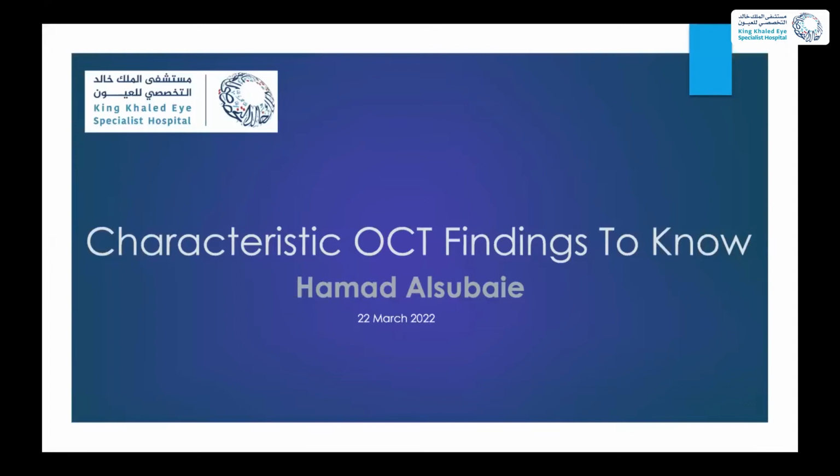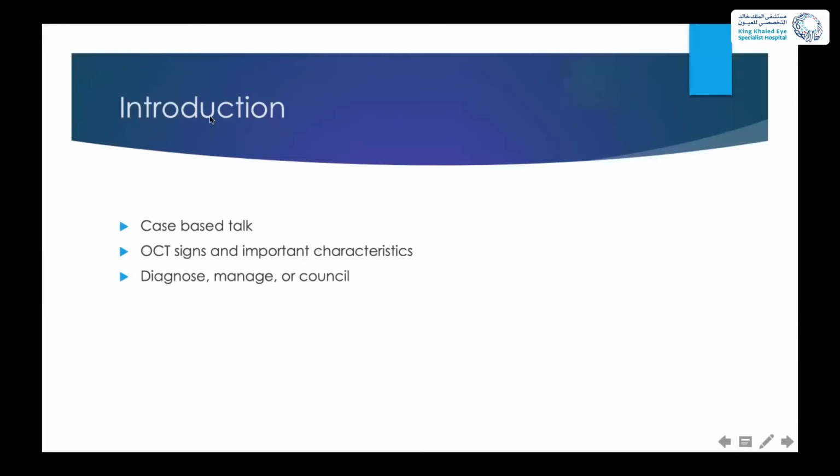So today I will present this topic, which is characteristic OCT findings to know. I thought about many topics to present, then I decided to present this topic, and I bring all the cases that I saw during my fellowship. These cases have OCT findings, and these OCT findings are characteristic for some diseases and some pathology. And these findings will help us, inshallah, in diagnosing, managing, and counseling our patients.